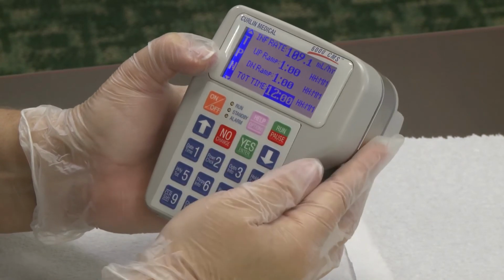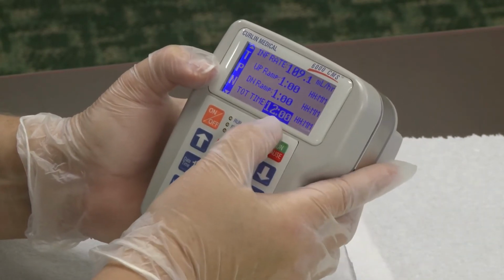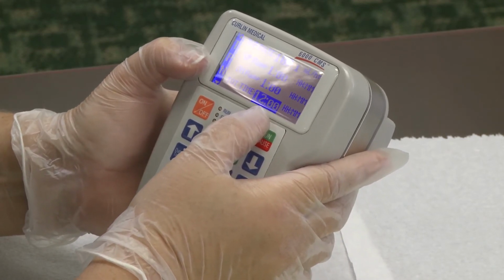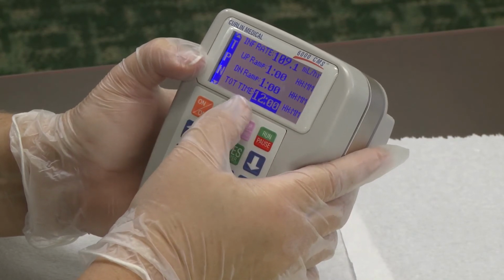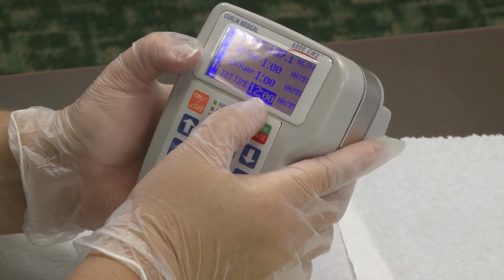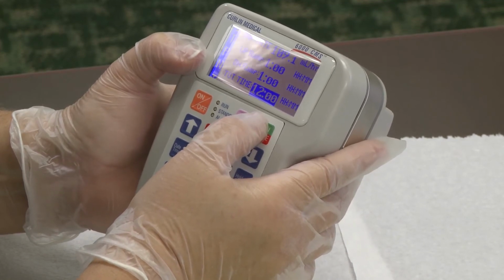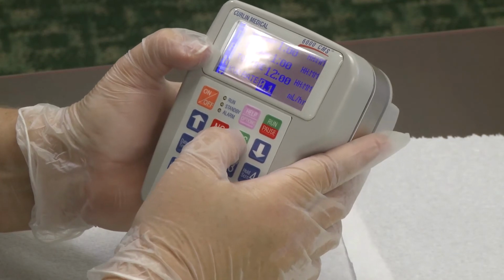And this one is set for 12 hours, meaning this whole bag is going to go in 12 hours, because this is a cycled TPN where it goes on and then off. Some patients are on their TPN for 24 hours, and they're going to do a bag change once a day, and it will be on constantly. This we're going to talk about is a cycled TPN that's only running for 12 hours a day, and I'm going to say yes to that.